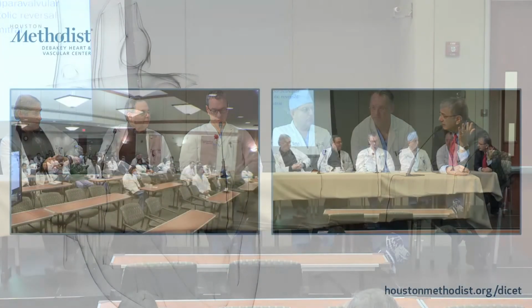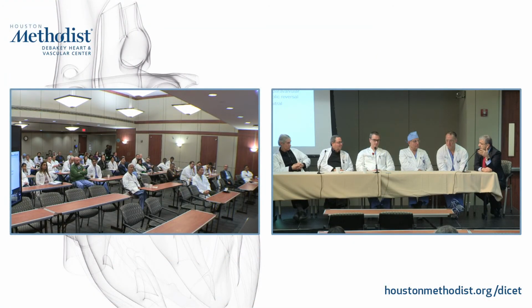Let me tell you, it's a challenge for us to write guidelines because you could write many things theoretical, but from a functional point of view, these summated areas were significant ultimately, and I certainly would believe the data there. We try to get beyond color Doppler. Color Doppler has limitations because of these issues. And you try to look with pulse Doppler in the aorta and the arch in the abdomen and see if there is a reversal similar to what MRI does.